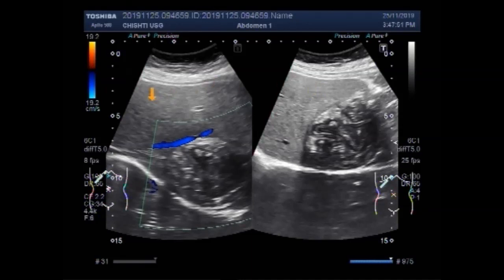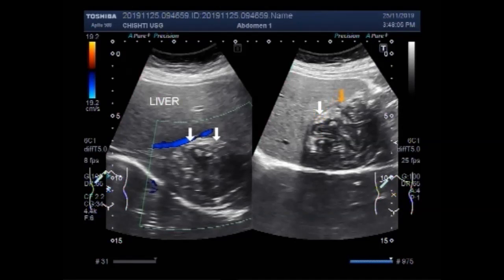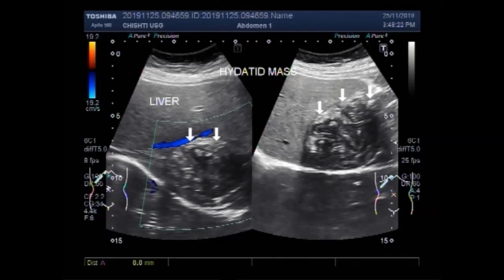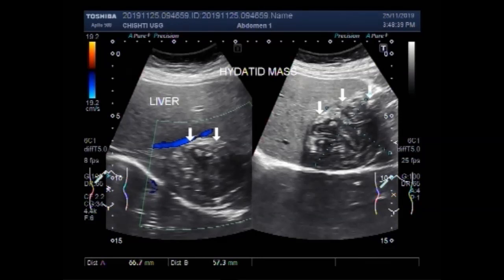This is the liver, and this one is the hydatid mass. Again, in this view it measures about 6.7 centimeters by 5.7 centimeters.